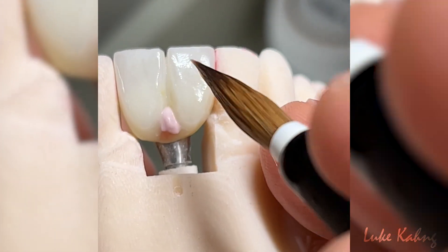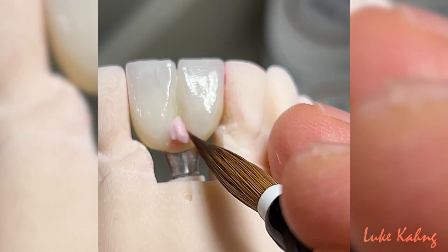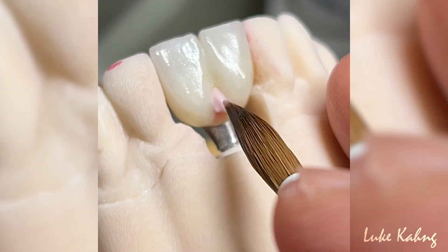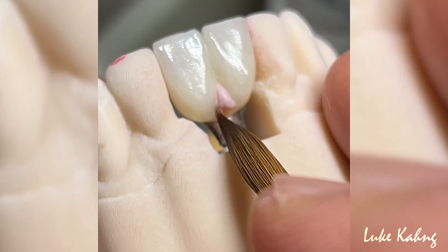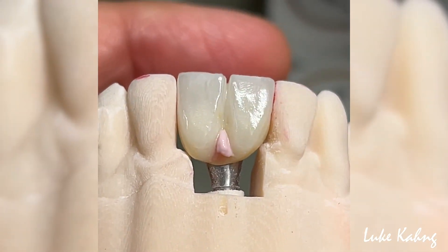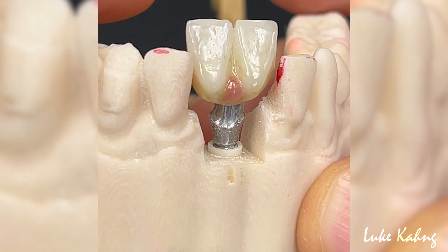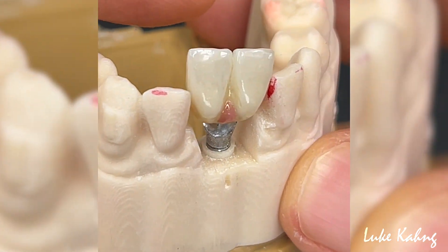Then, the pink porcelain of the zirconia is applied to replicate the gingival tissue. Once the pink porcelain has been applied, the zirconia is baked in the oven one last time.